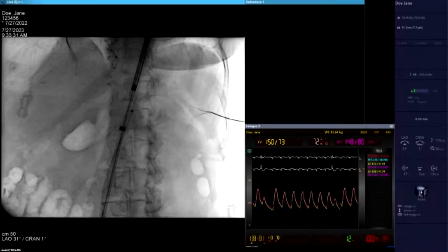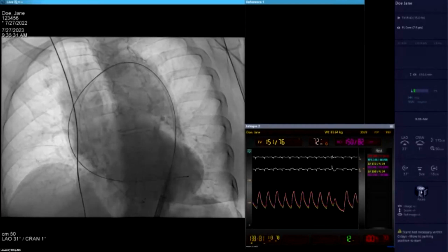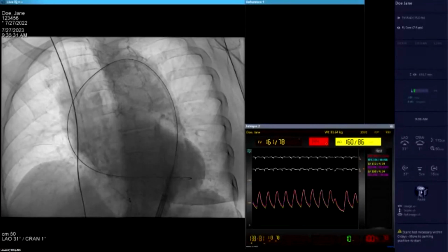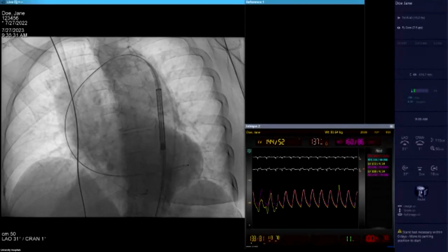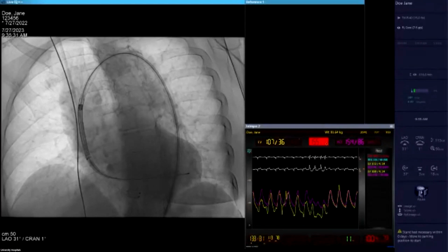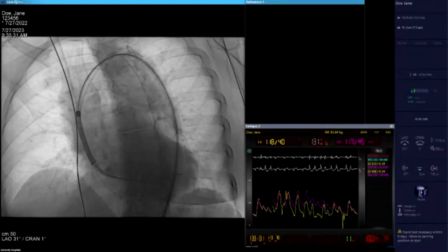And as I said, in the current study we're doing, the coronary cannulation one, 100% of the patients, 50 consecutive patients, we did 70 already. They all had, look at the valve crossing the arch here. The FX goes very smoothly, huh? Went very, very smoothly. No projection.